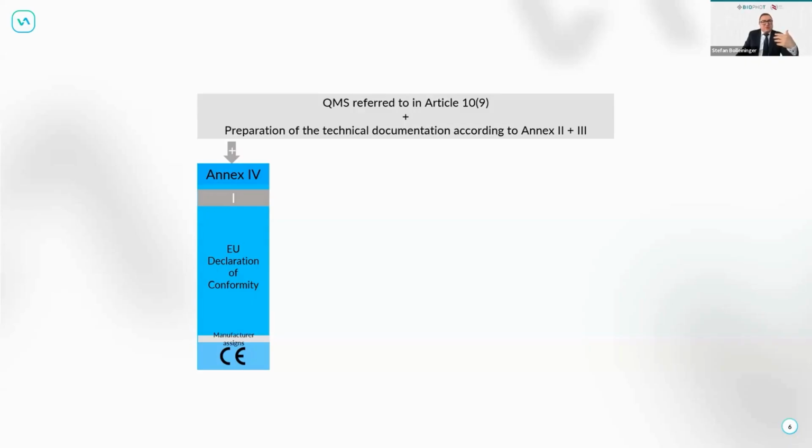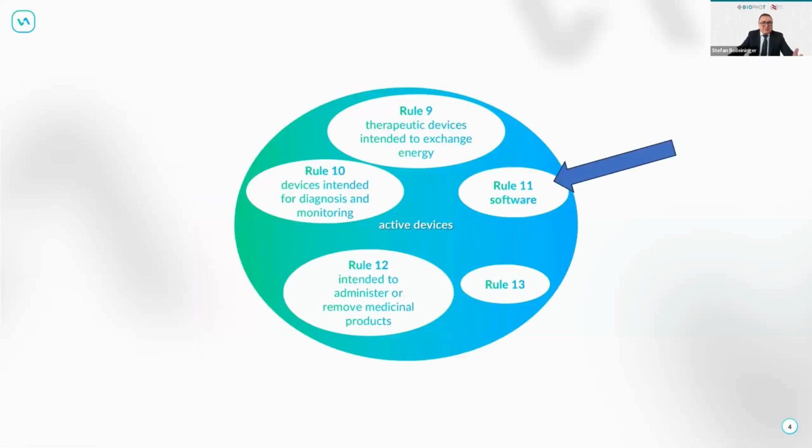The European Council gave out a new proposal on how to rephrase a few things of EU MDR and IVDR, and one of the things is, for instance, Rule 11 for medical software. There is a bit of a change, because when we think back into the past, prior to Rule 11, there was no rule about software, so software was just part of the other devices or not. And let me quickly go back, because that's something I want to explain a bit more.